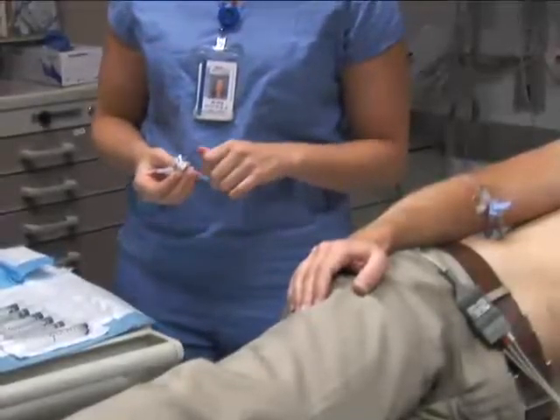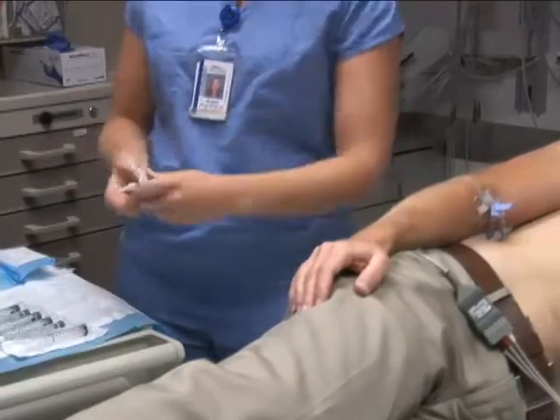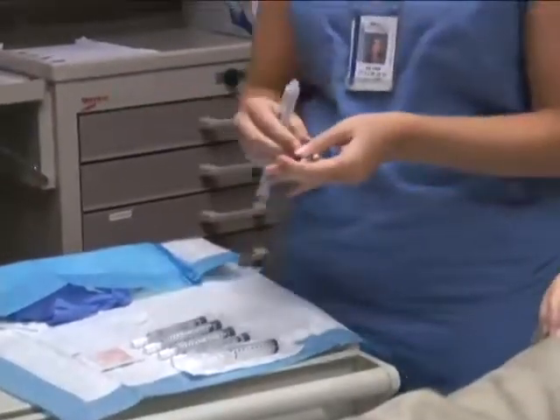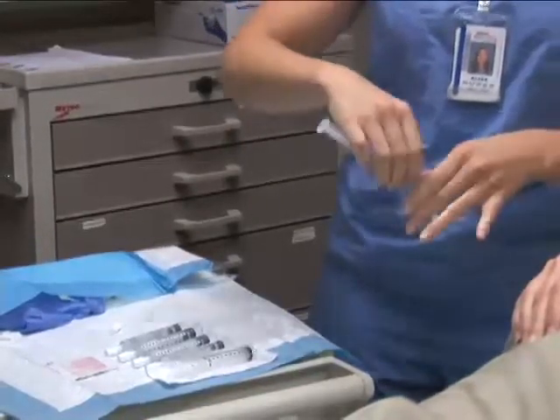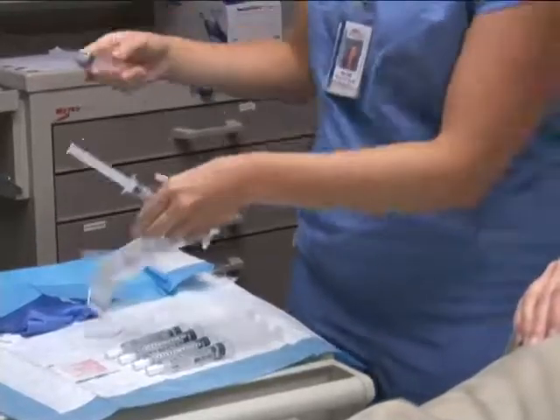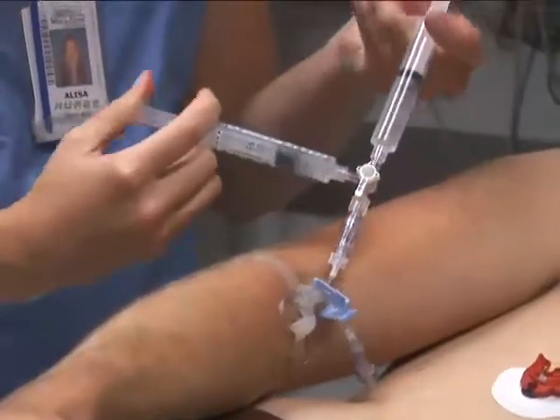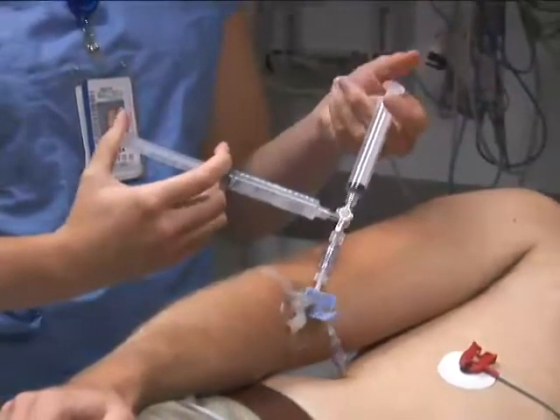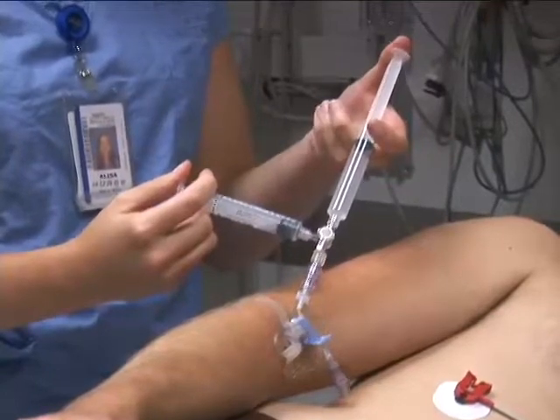A contrast effect is achieved by agitating the saline. Using sterile technique, one of the pre-filled 10-milliliter saline syringes is attached to the 3-way stopcock, which is turned off to the patient. Then an empty 10-milliliter syringe holding 0.5 milliliters of air is attached to the third port of the stopcock. Microbubbles are created by quickly and repeatedly pushing the saline air mixture from one syringe into the other. When the agitation is complete, the saline will look opaque, but there are no visible air bubbles.